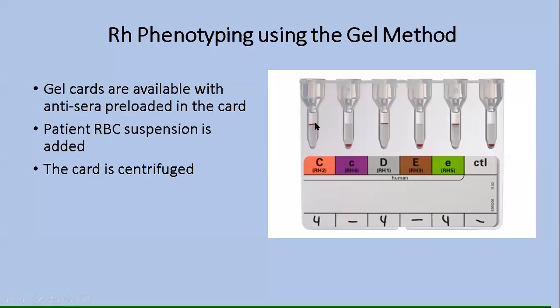So remember, with gel, when an immune complex forms, so in this tube here we have anti-C that found its target big C antigen on the patient, and we see the 4+ reaction lays on the top of the tube. So it's the opposite of the regular classic tube method of testing. So this would be a 4+, meaning that this patient has big C antigen. A negative, everything's going to sink to the bottom.